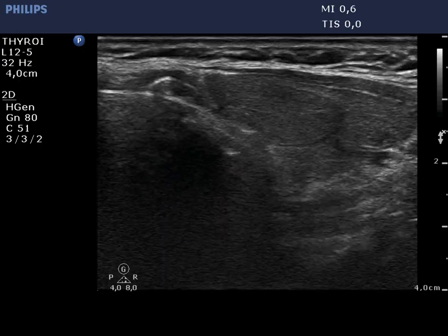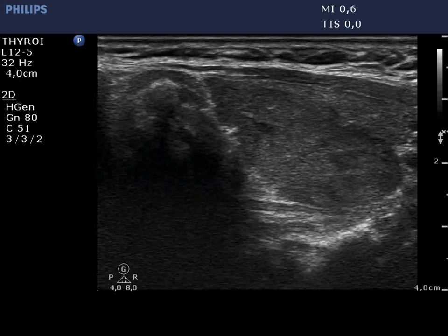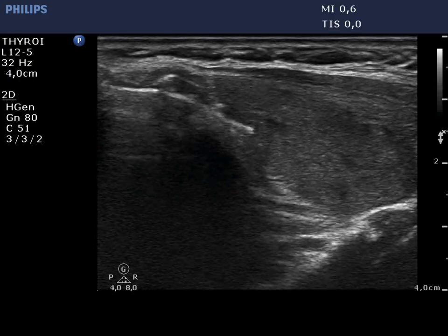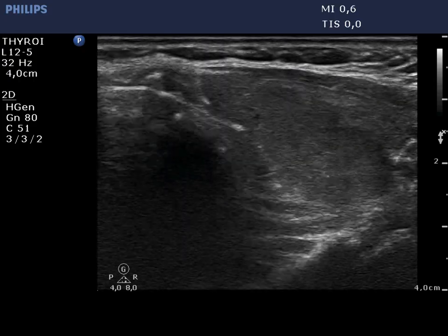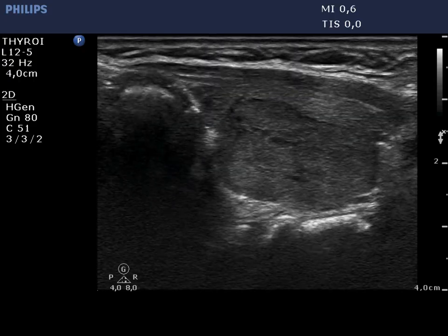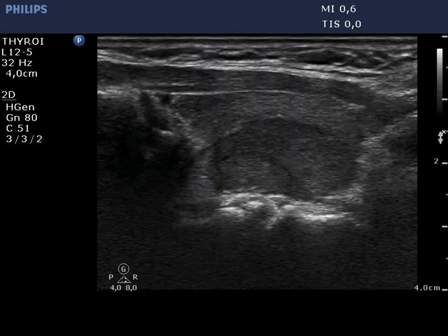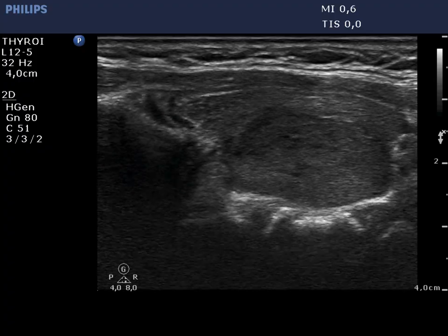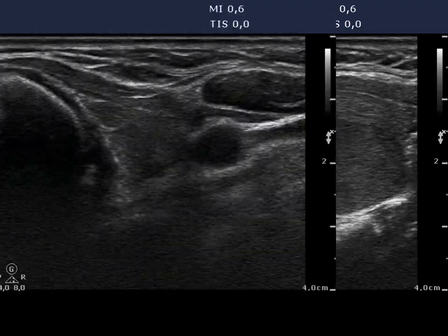This hypoechoic area runs all along the dorsal part of the left lobe into the isthmus. It is not a nodule, but a more active focus of lymphocytic thyroiditis.